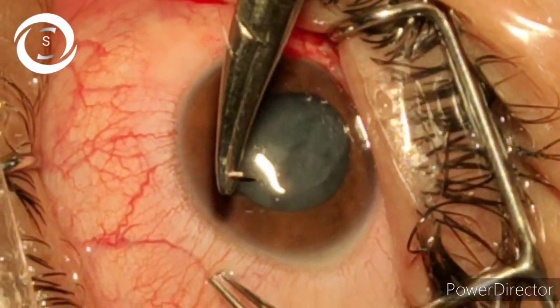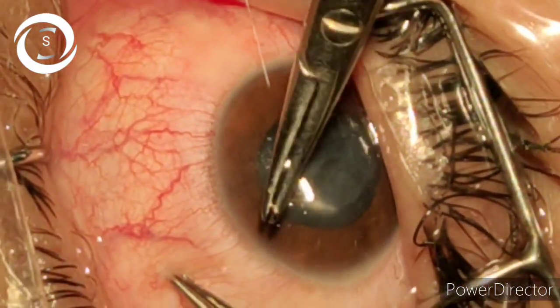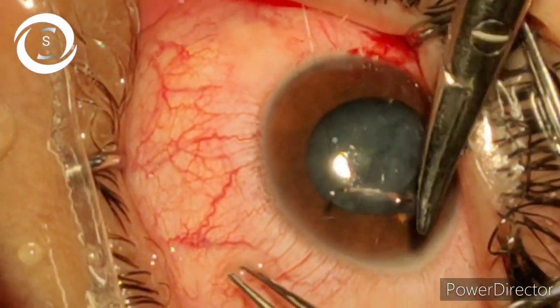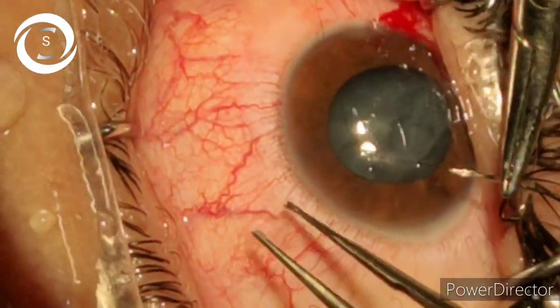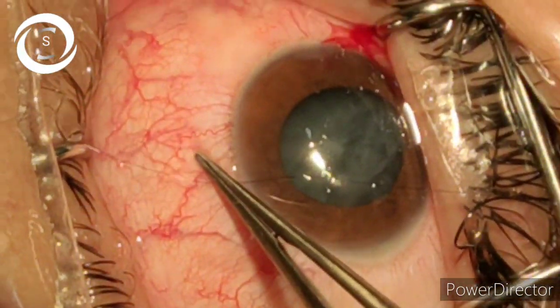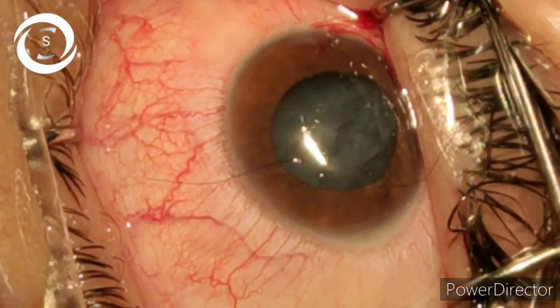As it was a small punctured wound, one 10-0 nylon suture is enough to seal it. I am applying a 10-0 nylon interrupted suture just below the central visual axis, so it should not be in the axis and it should completely seal the corneal wound.